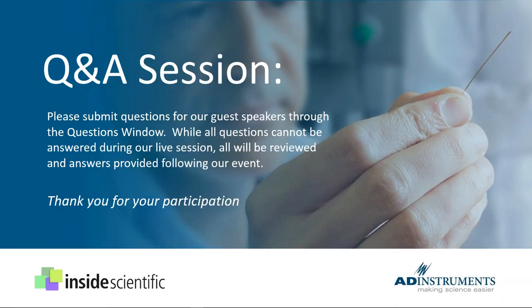That's an excellent question, and we struggle with this a lot. Most of the work that we published was open chest in the sense that we did a limited thoracotomy. We don't have to open the full sternum to get the catheter in, so a limited thoracotomy near the apex. We found that was the preferred method because we could control where we placed the conductance catheter, versus placing it down the carotid and going across the valve, where we were quite limited in where the catheter sat.